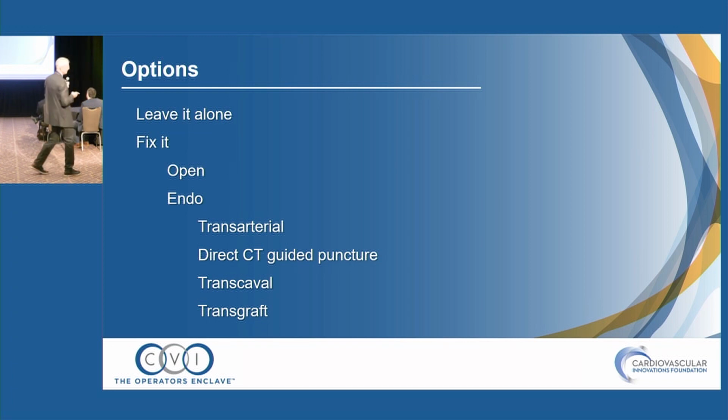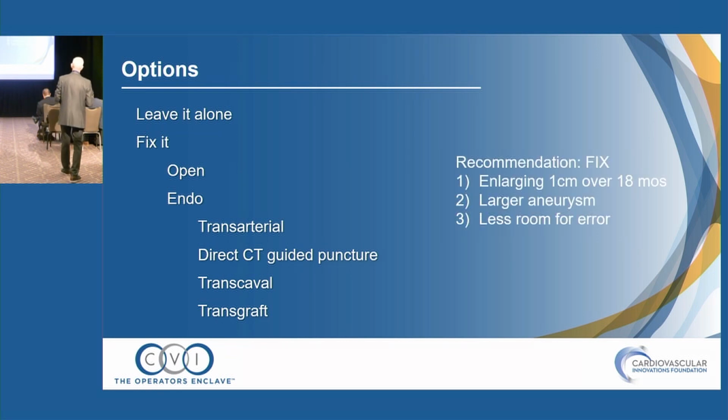And the other thing I would point out, it's very difficult to know for sure what kind of endoleak you have. Sometimes our radiology colleagues say, oh, this is a blank and blank. There's a guy down at Methodist in Houston. He's one of the Siemens guys, but he really pushes the 4D CTA, the time-resolved CTA, for really helping to define the nature of the endoleak, where you can see CT over time instead of just as a snapshot. And I think it does help sometimes to differentiate whether it's a type 1 or type 2.